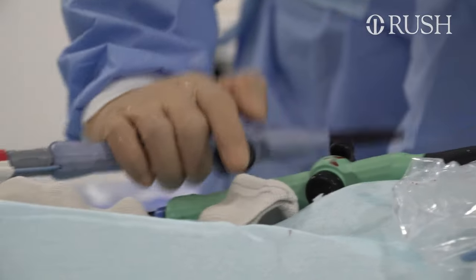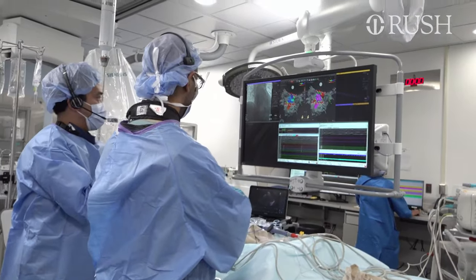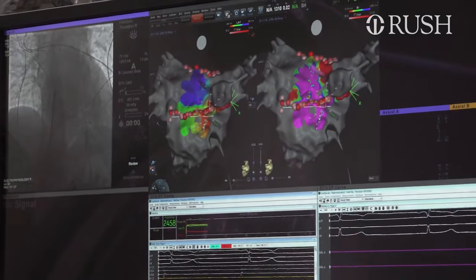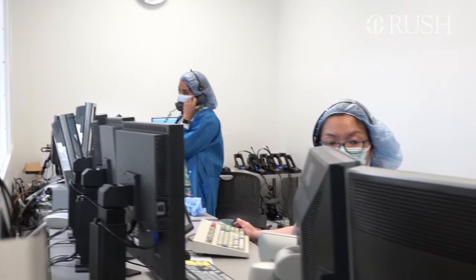So it looks like one of the areas where we ablated recovered on the bottom. So we're gonna go back with the RF catheter to ablate a little bit more there. Do you see that? There's an early spot. Yep. You see that fractionated signal? Let's come on ablation here.